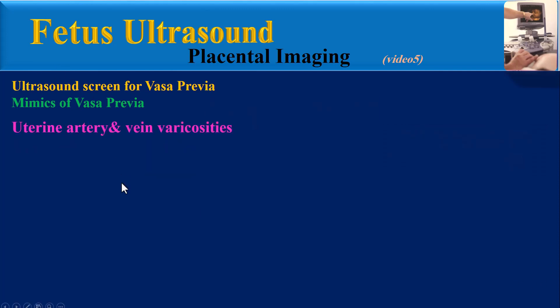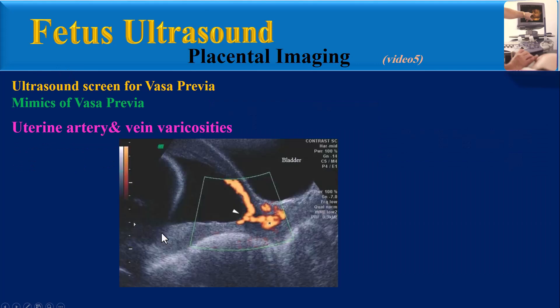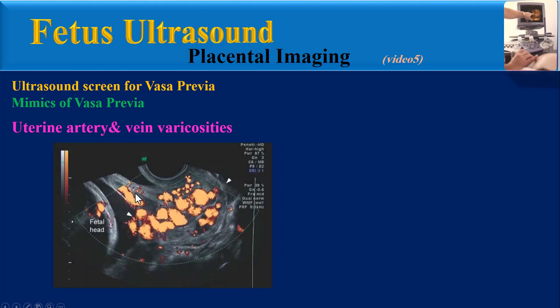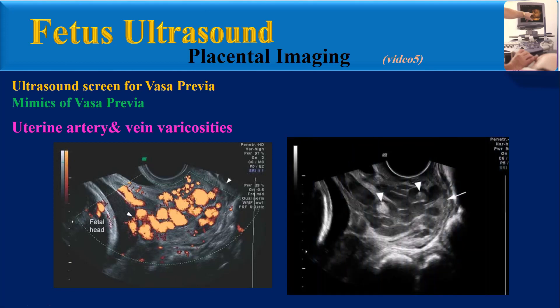Another mimic is uterine artery and vein varicosities. A transabdominal color Doppler image at 23 weeks gestation shows dilated varices along the uterine cervix, with dilated lower segment vessels communicating with the cervical varices. An arrowhead indicates the internal cervical os. A transvaginal power Doppler image of the same patient at 28 weeks shows severely dilated venous blood vessels replacing most of the normal cervical tissue. A transvaginal grayscale image at 28 weeks shows cervical varices with two echogenic thrombi.